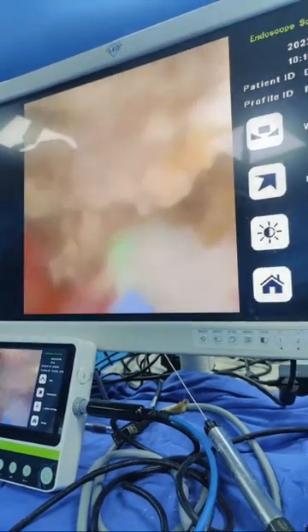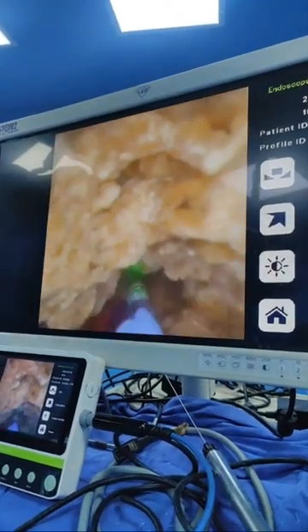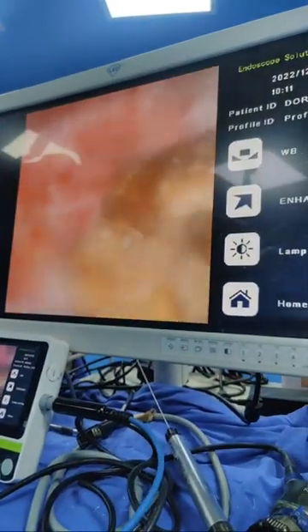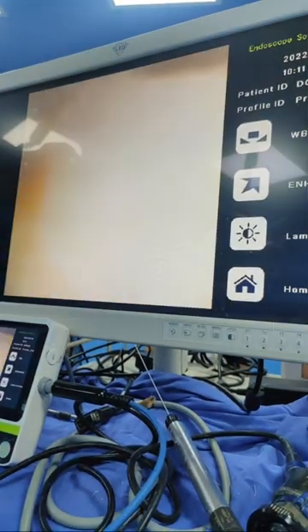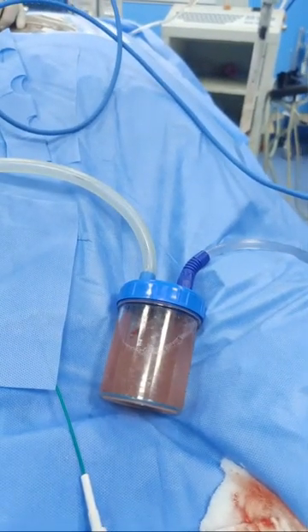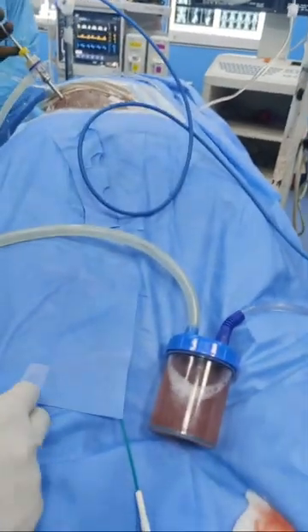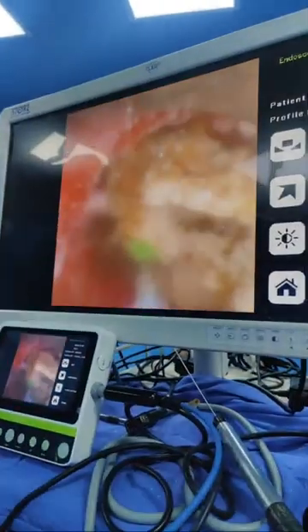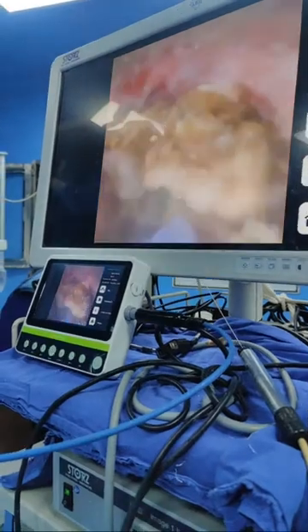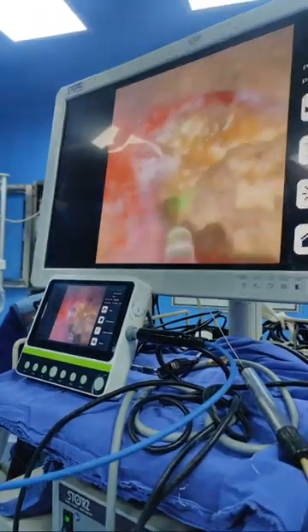Now, because the suction is there, the fragment is not going into the system. These all fragments come in. They come by suction automatically.